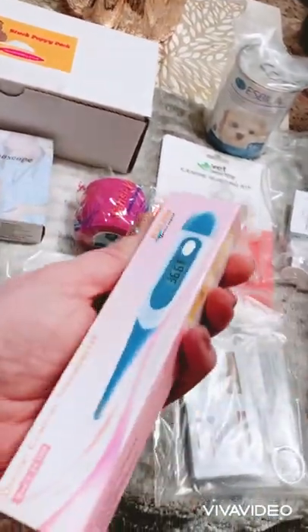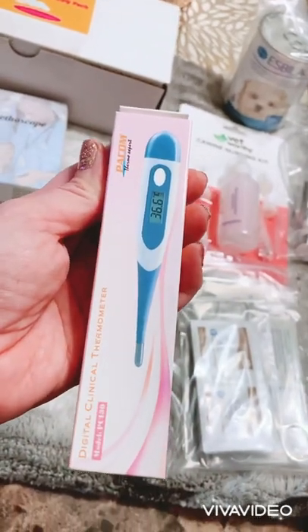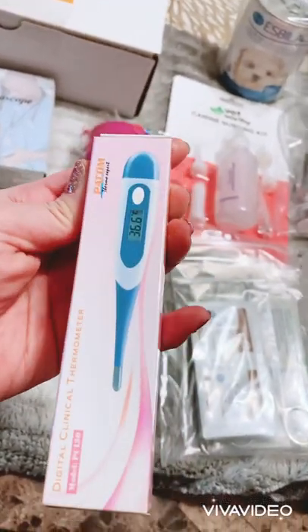This is just a digital thermometer — that's pretty self-explanatory. This will help you take the pup's temperature as well as the mom's.